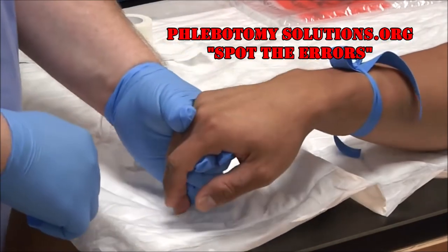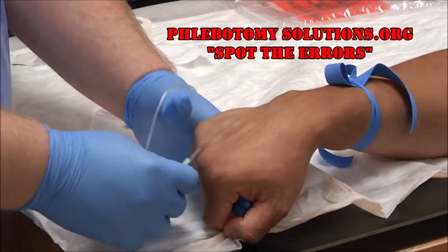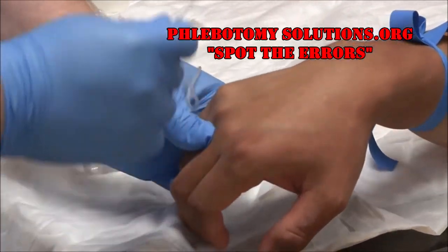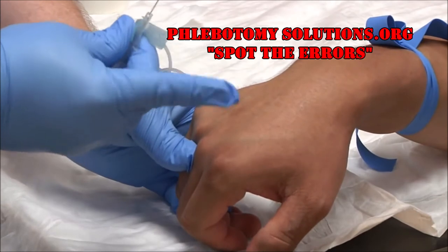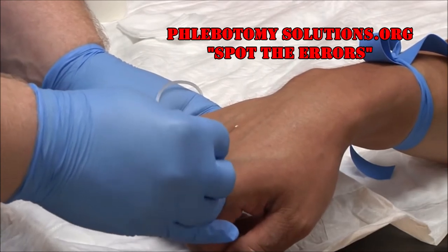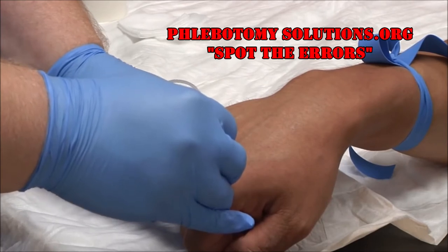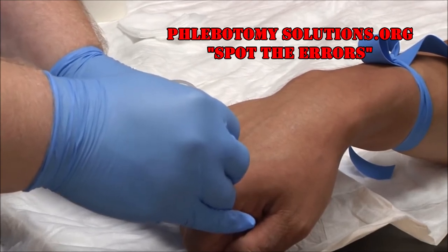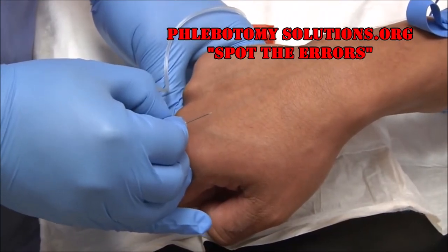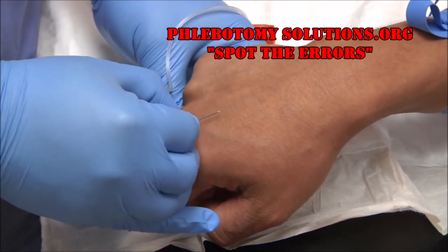Go ahead and grasp a hold of your patient. Remove the sheath from the needle end. Place the textured ends of the butterfly in between your fingers. With the butterfly, you only need a 10 to 15 degree angle when inserting your needle. Warn your patient ahead of time that this may sting just a little bit. On the count of three, you'll insert — say one, two, insert, then three, so the patient is not anticipating the pain.